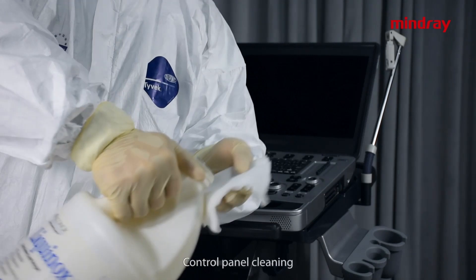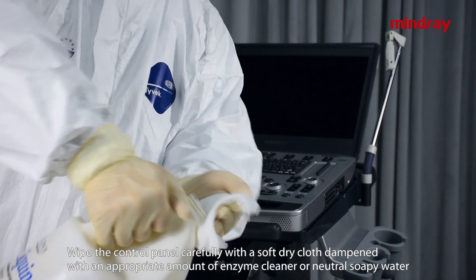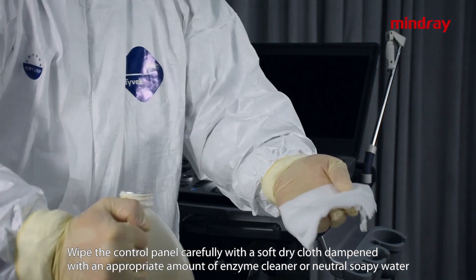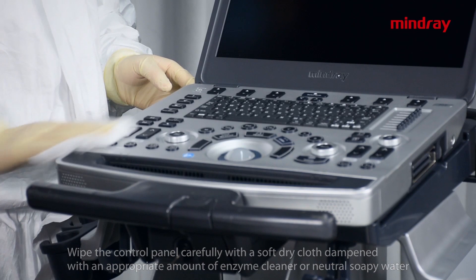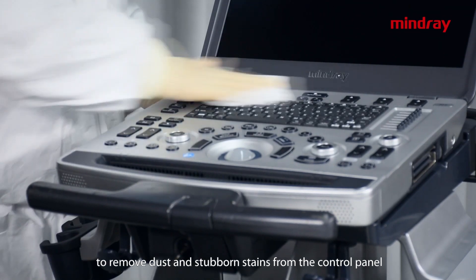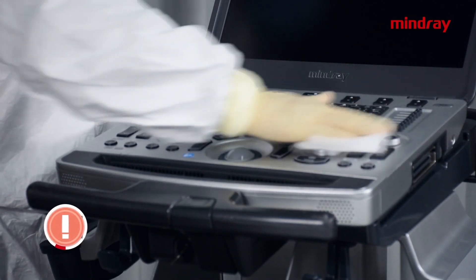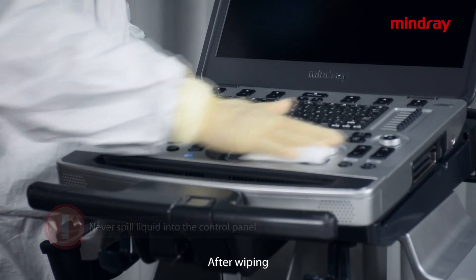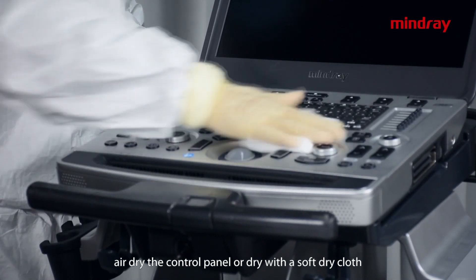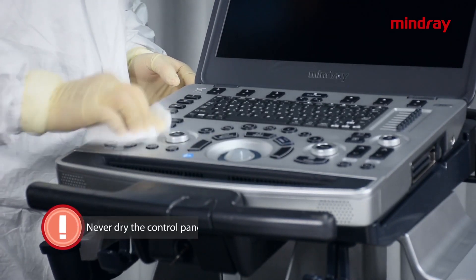Control panel cleaning: wipe the control panel carefully with a soft dry cloth dampened with an appropriate amount of enzyme cleaner or neutral soapy water to remove dust and stubborn stains. Caution: never spill liquid into the control panel. After wiping, air dry the control panel or dry with a soft dry cloth. Never dry the control panel by heating.